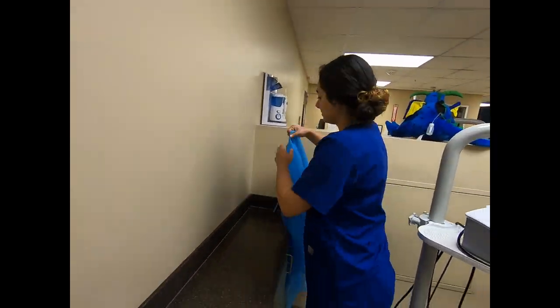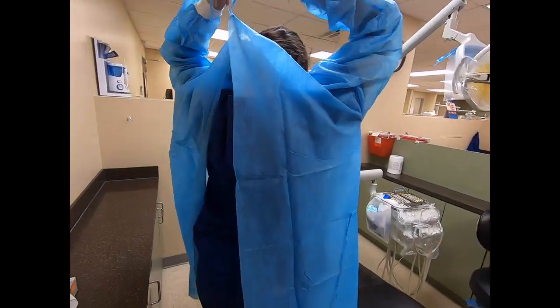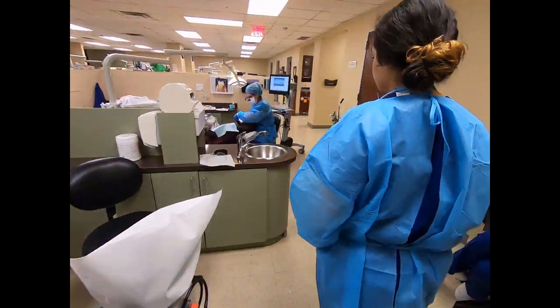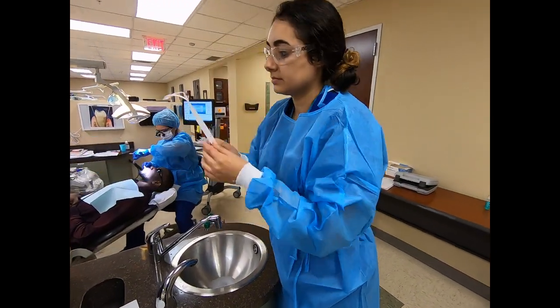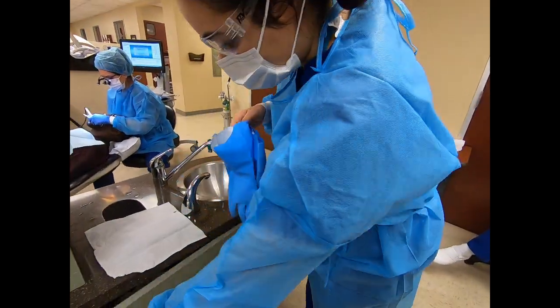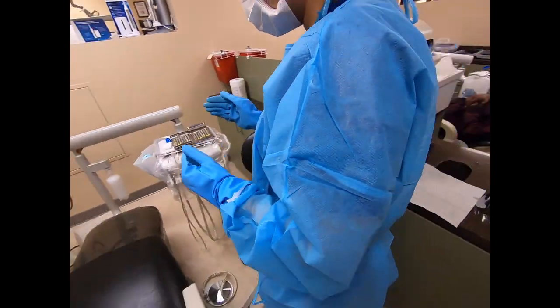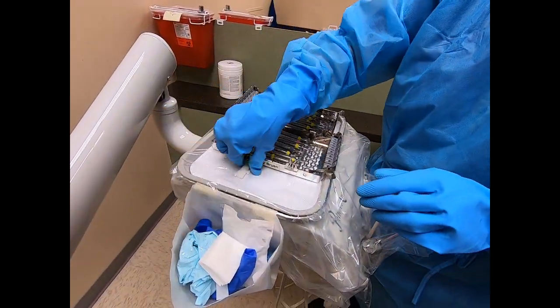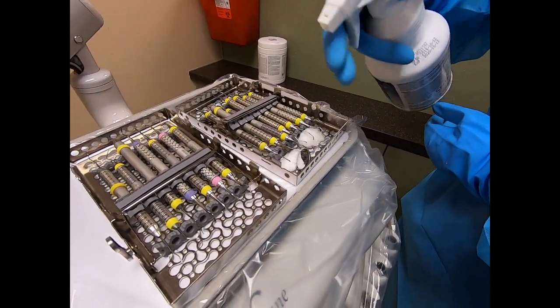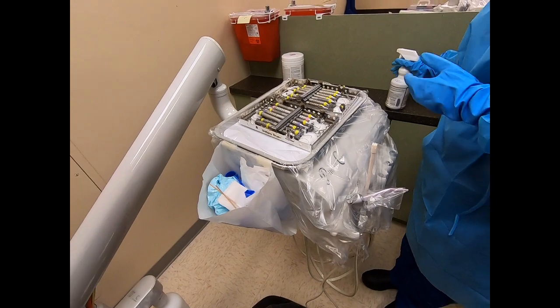When you return to the room, you will need to disinfect and clean the area. Replace your gown, goggles, a clean mask, and put on your utility gloves. You will want to remove trash from the cassette, inspect and organize all of your instruments, and then place on a transportation tray. The cassette is open and spray the instruments thoroughly with Pro-EZ foaming enzymatic spray.